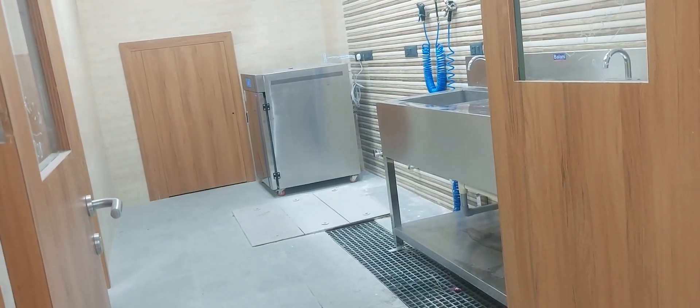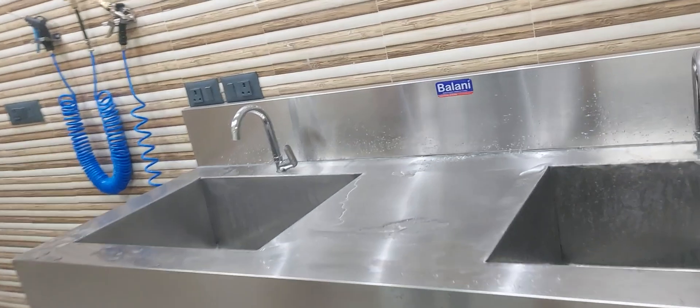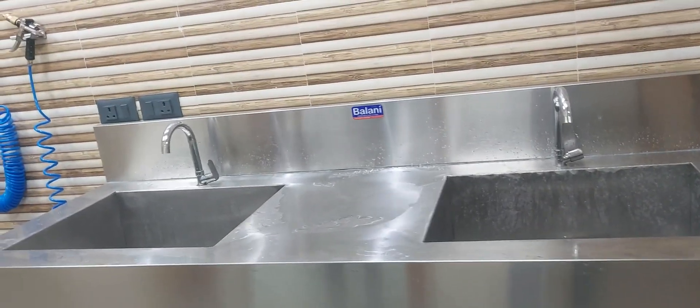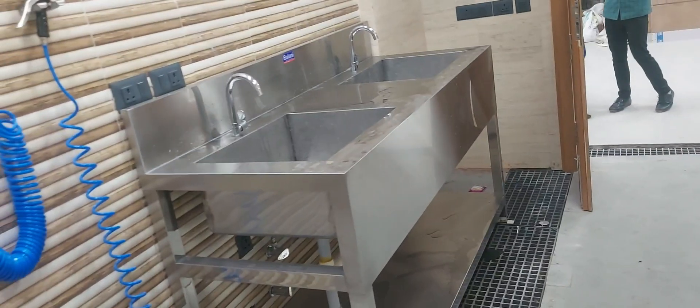Hi friends, this is Suraj from Luxembourg Technology Center. This is our new setup for the CSSD at Prem Hospital, Merat, which is very near to Delhi. We have supplied this for a complete project as an OEM, for one of our customers.